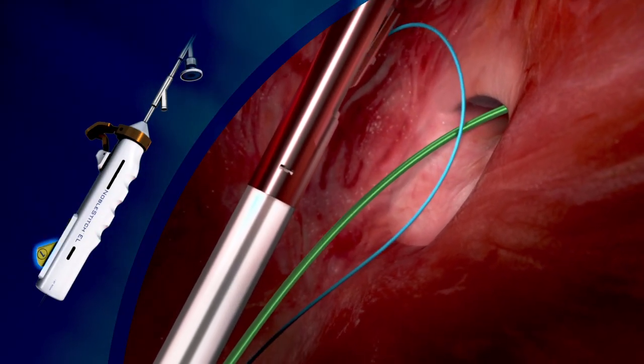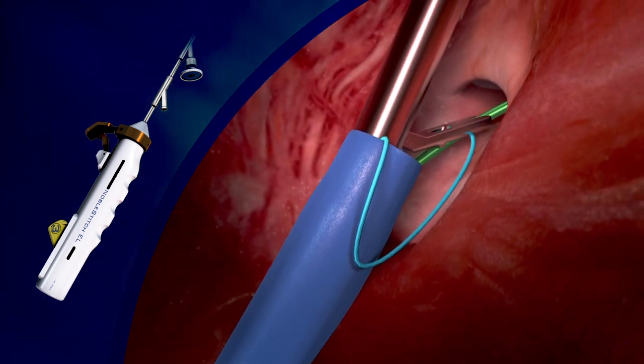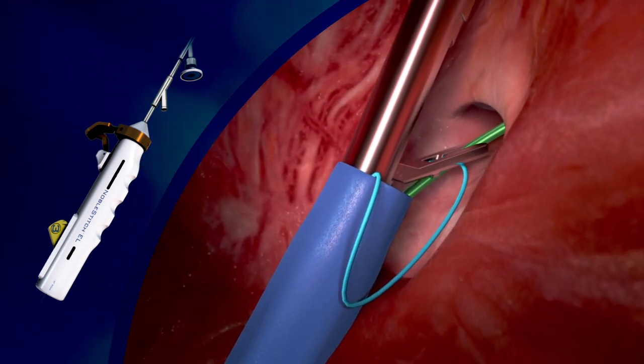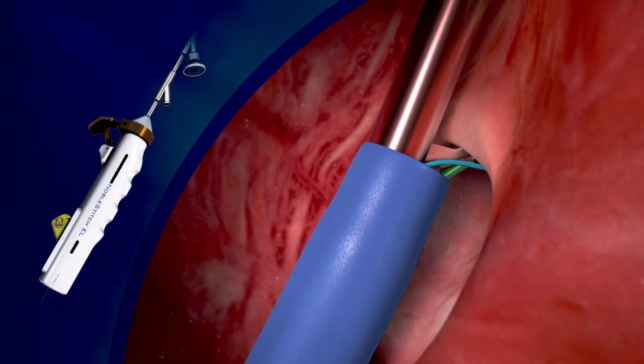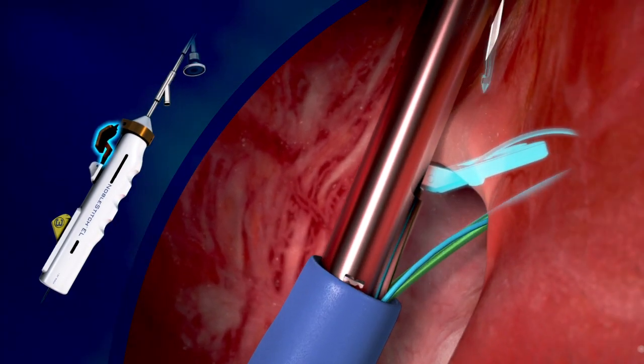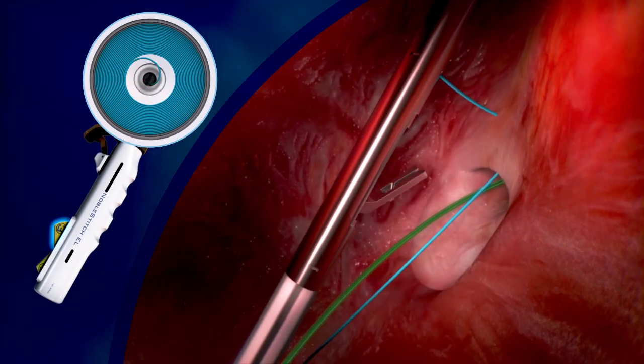The device is advanced forward and the suture carrying arm is opened. Then the sheath is advanced, drawing the device into the oval fossa. The entire system is advanced forward until it engages the secundum septum, then the sheath is drawn back as the needle is fired through the secundum septum, picking the suture up.